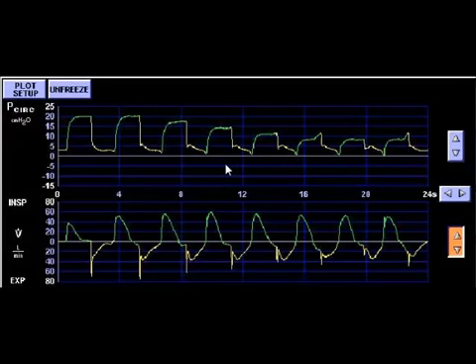And say you're targeting a tidal volume of 500, the patient's sucking back so much they're getting a tidal volume around 700, it's going to start titrating my pressure down. It's saying, hey, I want to target that 500, let's decrease the pressure. So you see the stair stepping here. As you can see, the pressure gets lower and lower until it's meeting that target tidal volume, and we have this low pressure. So that's good, we have a consistent tidal volume. However, this increases the workload of the patient.